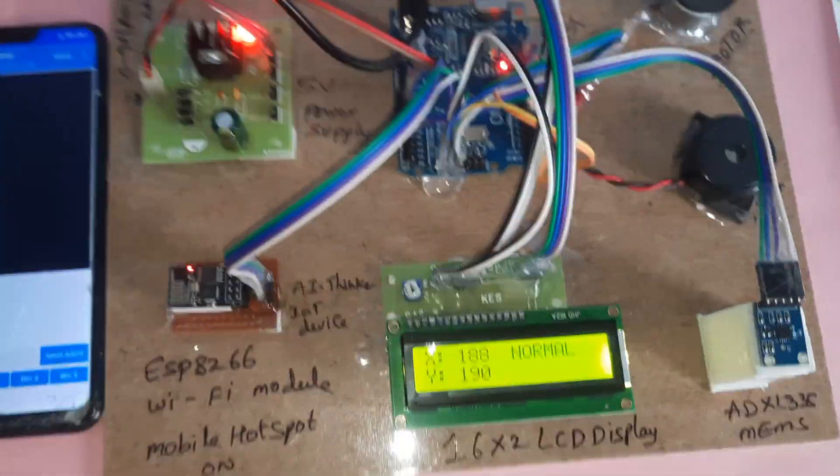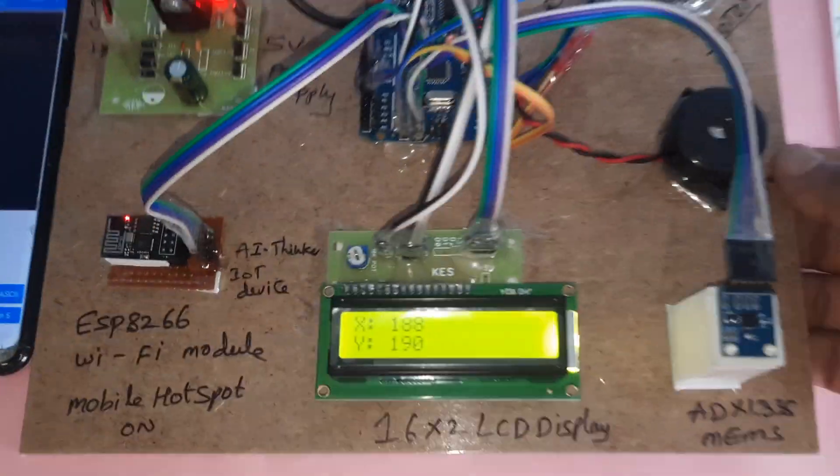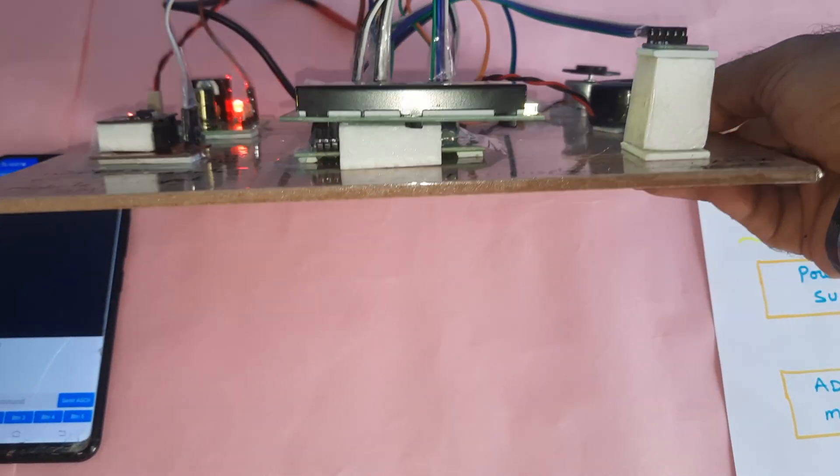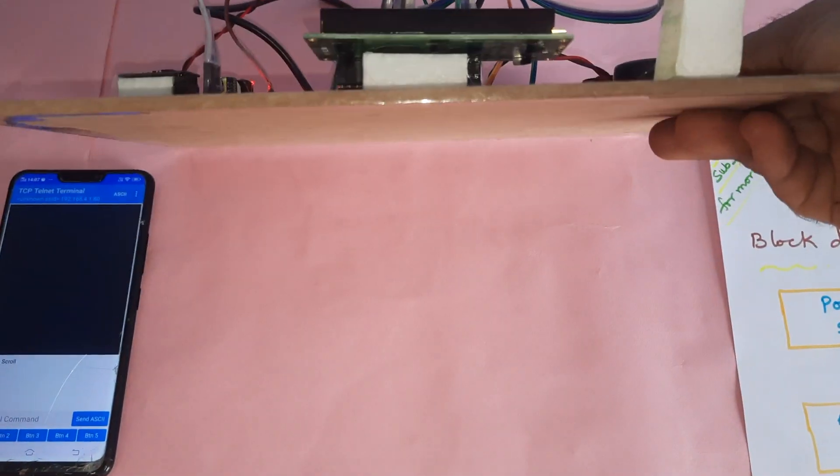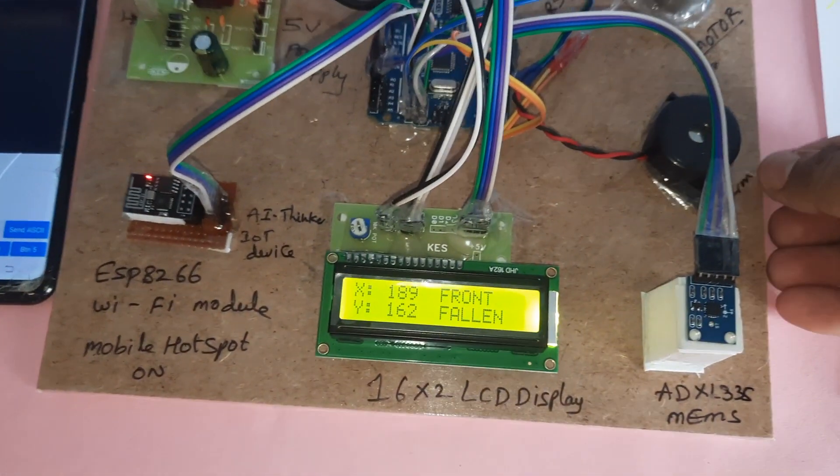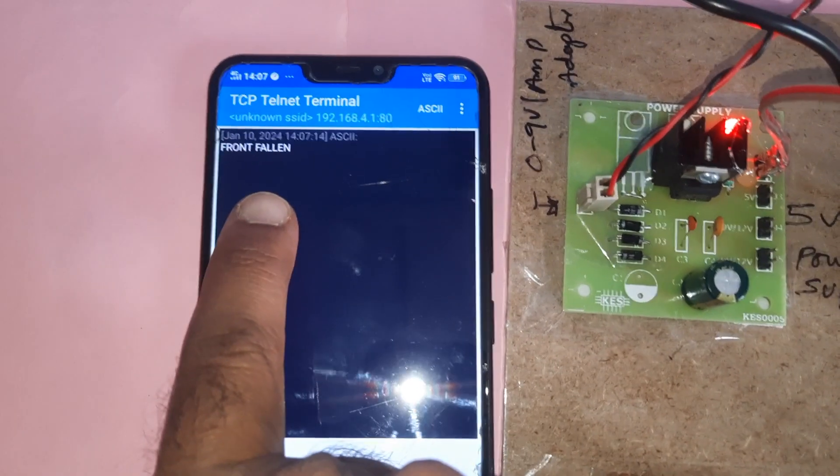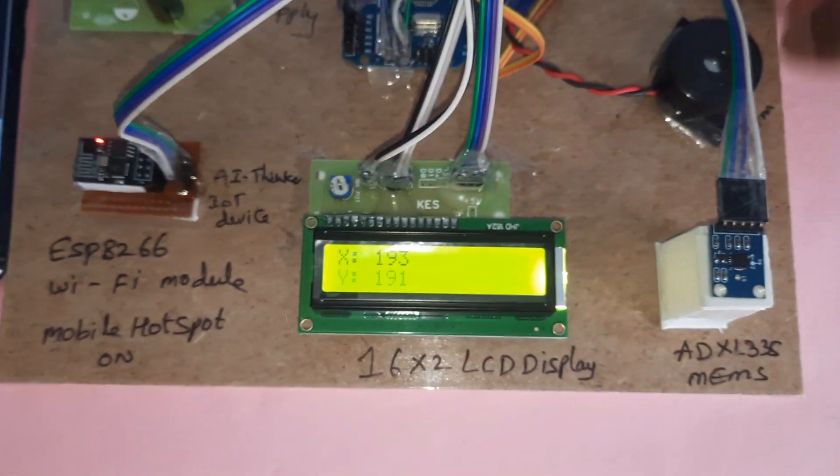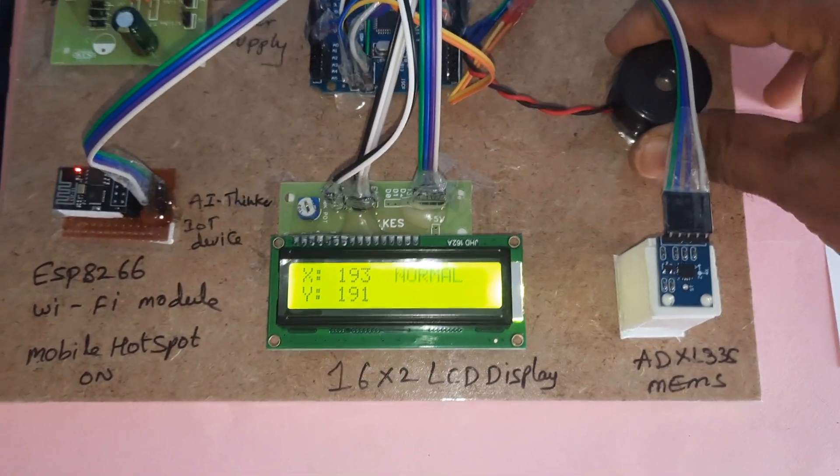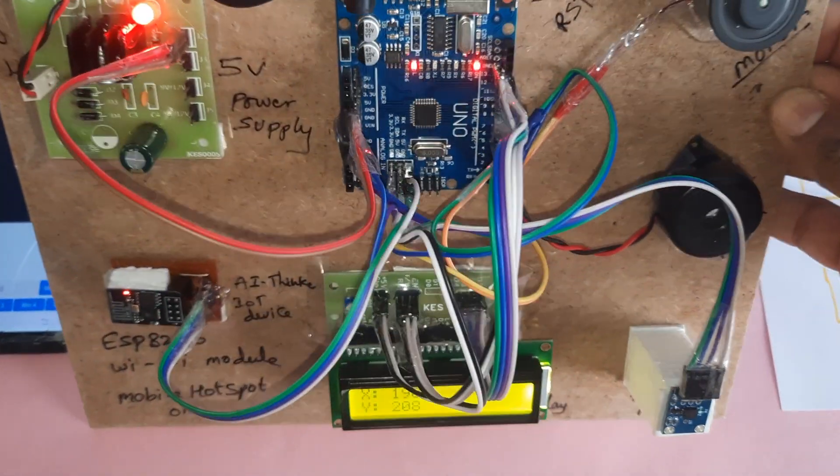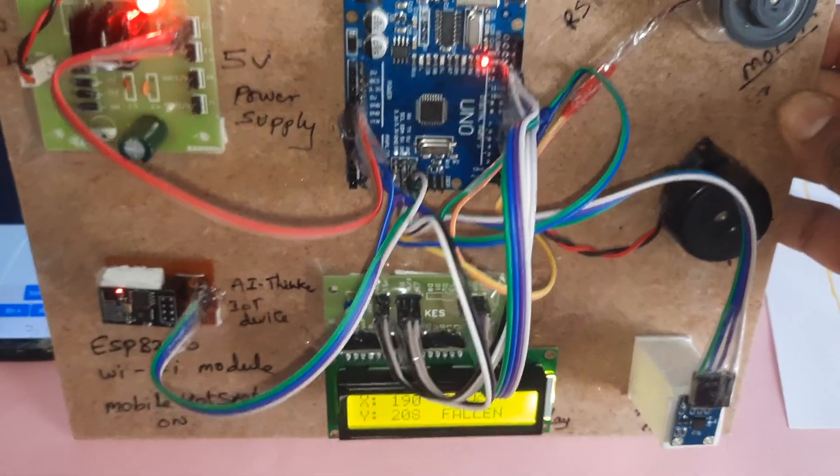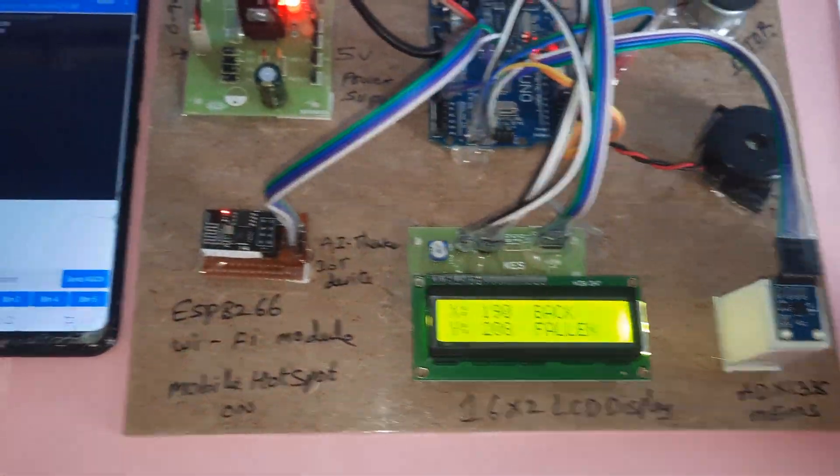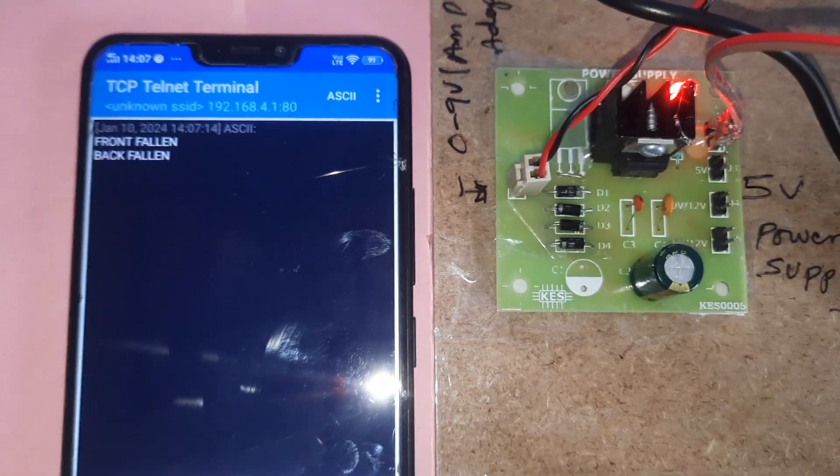Front fallen, okay. Back fallen, back fallen.